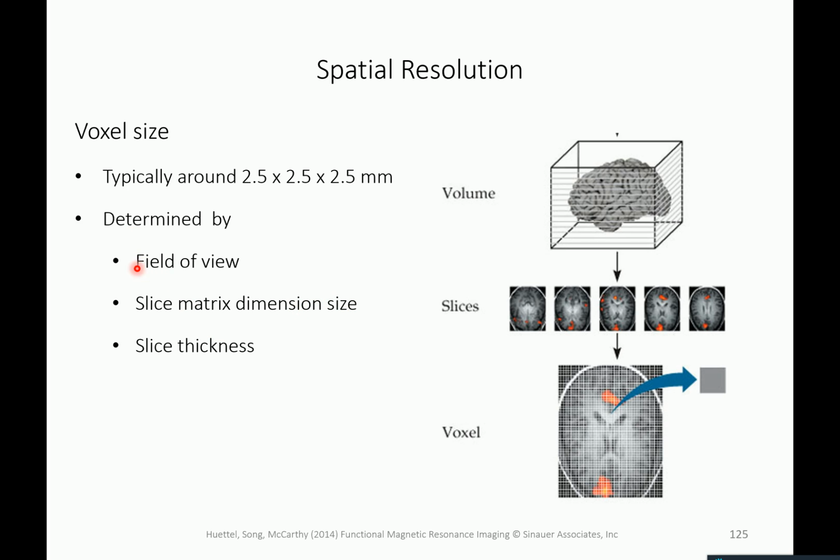So the in-plane resolution depends on how your whole setup is. And then the voxel size depends not only on how big things are in the XY plane, but also on how thick the slice is, which depends on how many slices you want to acquire and how specific you can be with the Larmor frequency. So this is basic. Smaller voxel sizes require longer volume acquisition times, because there is a coupling between the time of the imaging process and the highest frequencies that you can encode, which we will see in more detail in January.